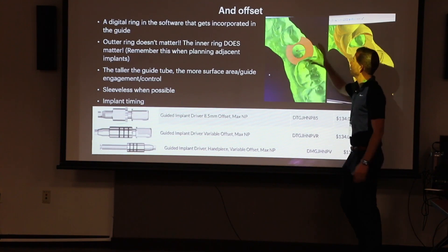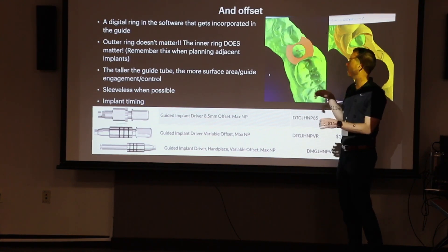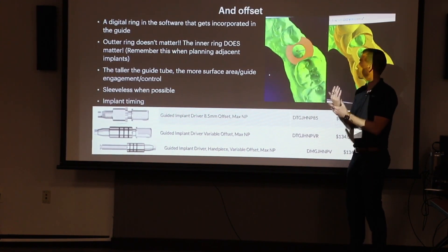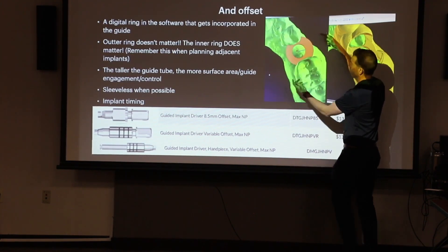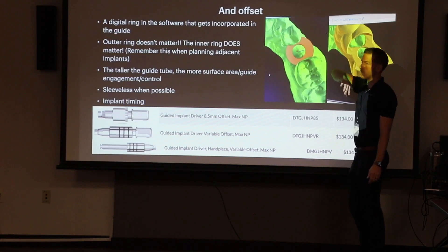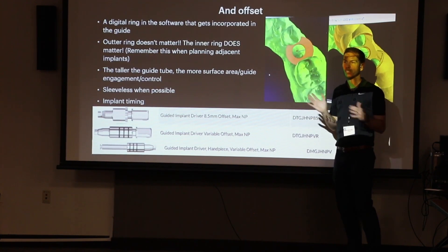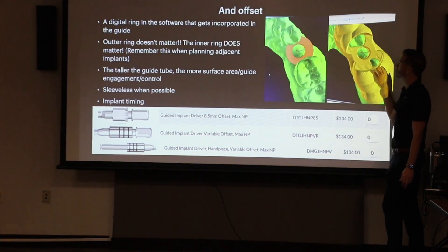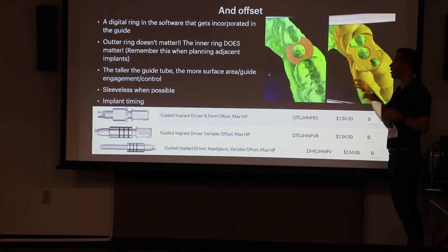So what is a guide tube? This guide tube is the yellow ring you're going to see in the software — it's associated with the implant. If you went straight down through that guide tube, that digital circle, it's going to hit your implant right in the center. When we put these guide tubes in, there are two aspects: the outer portion and the inner portion. People get confused — the outer portion doesn't matter if it's touching teeth or overlapping with another one.